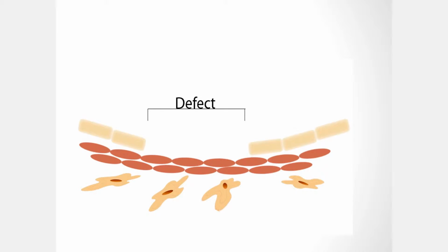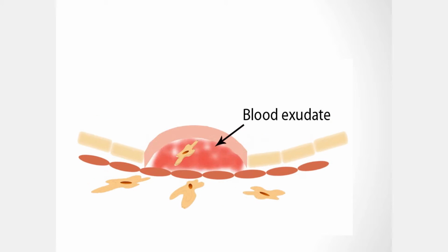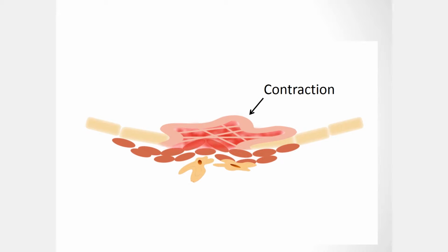This small slideshow and animation shows the defect, which is shown and labeled, and the muscle underneath of it. Normally when we place a graft in this area and tie it just with sutures, over time what happens is that a blood exudate forms, and scar tissue really begins to contract and to cause this area to essentially break down and to require multiple grafts.